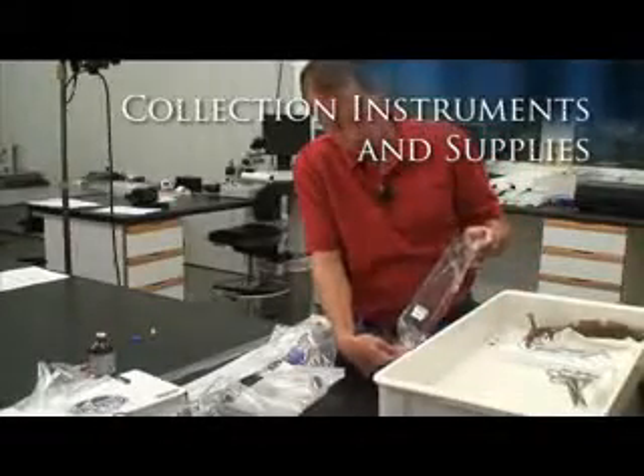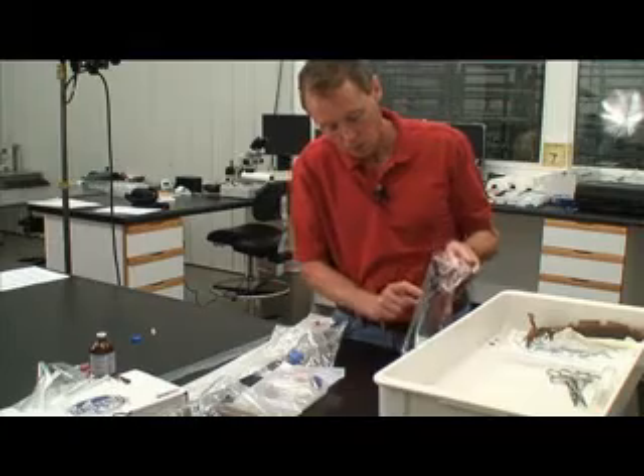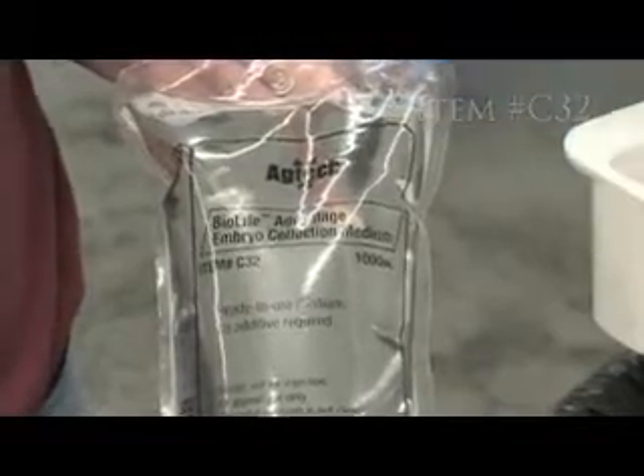Select a 1-liter bag of DPBS, Dulbecco's Phosphate Buffered Saline, containing the surfactant polyvinyl alcohol (PVA). An example of this is BioLife Advantage Collection Medium.